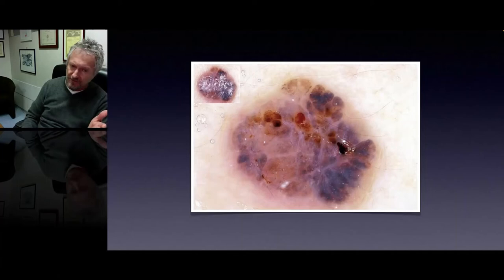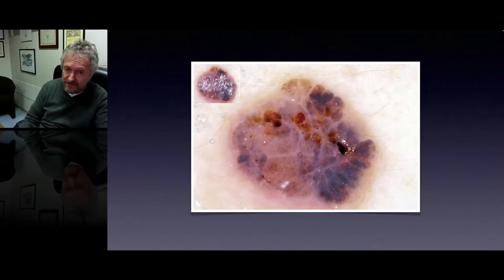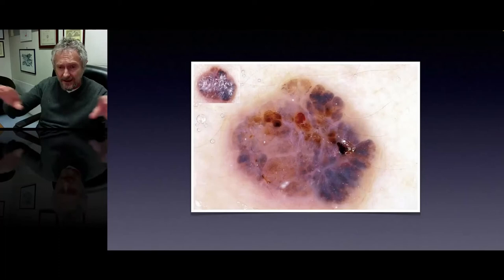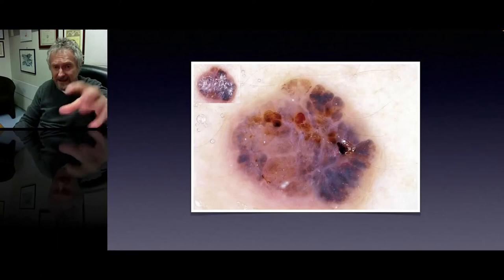The introduction of dermoscopy has definitely changed dramatically the ability of clinicians to recognize basal cell carcinoma, especially in the pigmented variant, as you can see here. It's extremely easy because of these blue-gray islands of pigment, especially seen at the periphery. This kind of periphery was called leaf-like areas. In addition, we have arborizing vessels and multiple ulcerations, as you can see in this case.